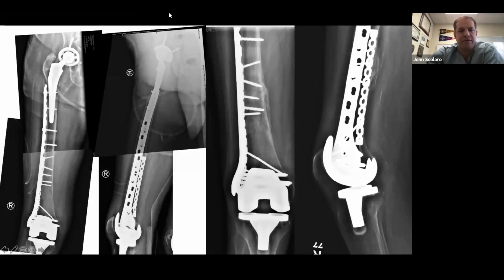Every time that we see lag screws like this, we see the final images like we do on the right hand side, where we end up getting a little bit of callus, because honestly, by the time they move the patient to the gurney and then back over to the recovery room, I guarantee you those lag screws have already started to shake a little bit. So the purpose of that plate as a clamp, and the purpose of the lag screws, is really just to set yourself up for the more dominant implant.